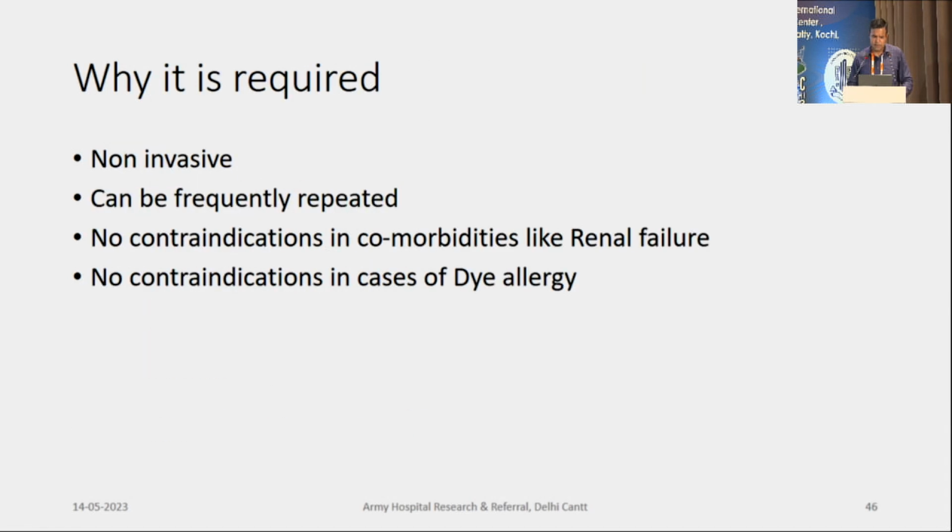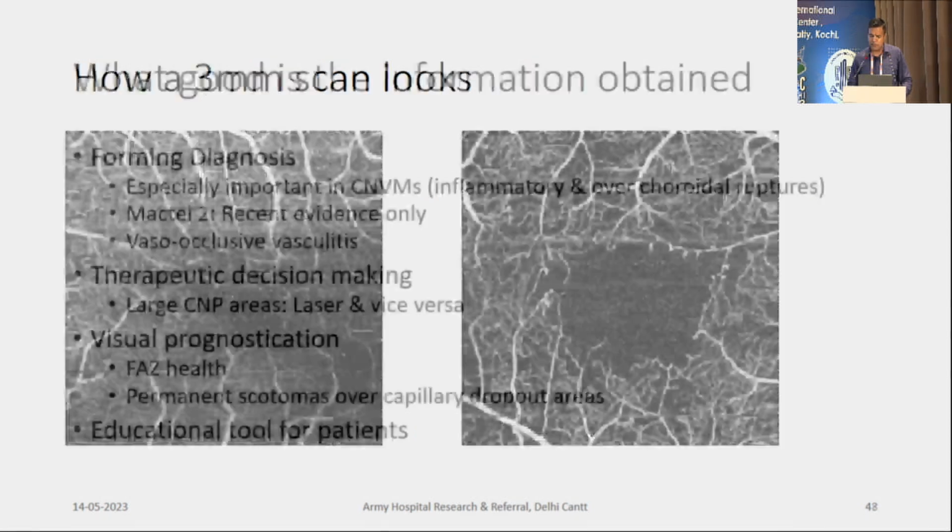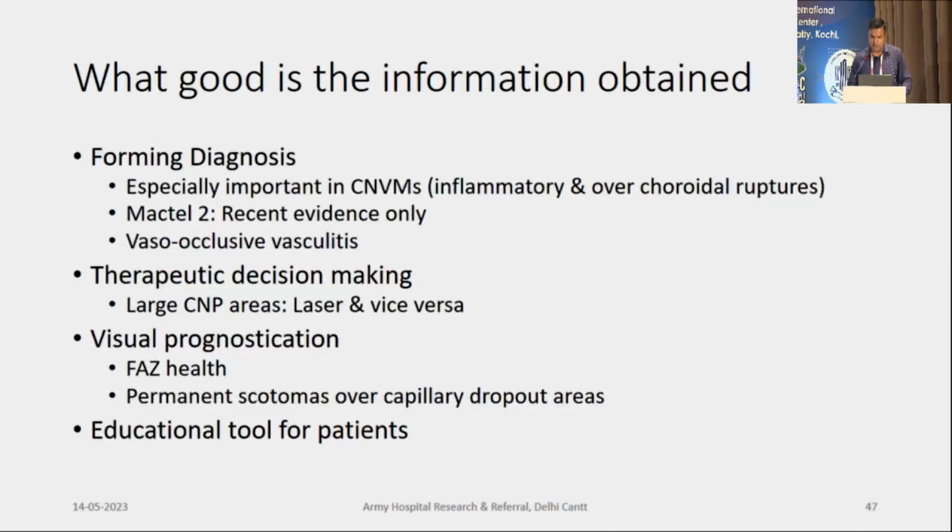So why we require wide field OCTA? It's a non-invasive modality. It can be frequently repeated, and there are no contraindications to it like comorbidities of renal failure, and no dye allergy exists. So it is important to form a diagnosis, especially important in CNVMs, especially the inflammatory CNVMs and CNVMs occurring over choroidal ruptures, where the OCT alone will not be able to guide you towards a hyperreflective layer, which you will presume to be a CNVM.